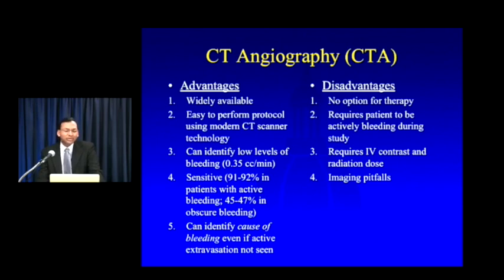You know, I'd been trained as a resident and a fellow to think that, okay, we should be doing colonoscopy. Why are we doing these CT scans again? Aren't we just wasting time? Are we actually ever going to be able to make a diagnosis that's going to help a patient? But honestly, over time, as I've seen more and more of these cases, I've come around. And I now truly believe that patients with lower GI bleeding should always start with a CT scan, especially when they're hemodynamically stable, and that it is certainly a better initial diagnostic test than any of the other alternatives I've talked about earlier.